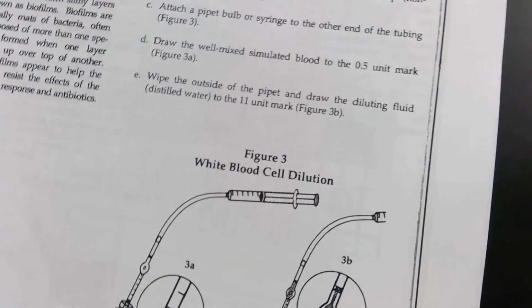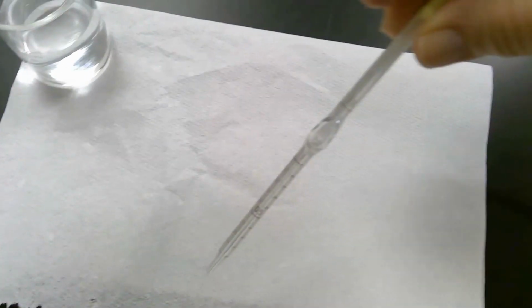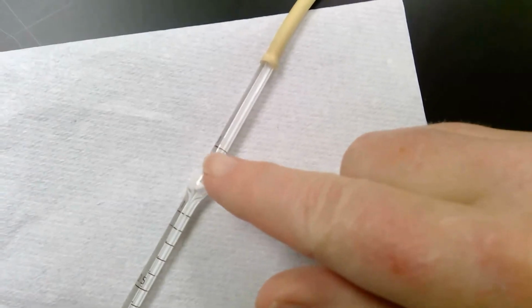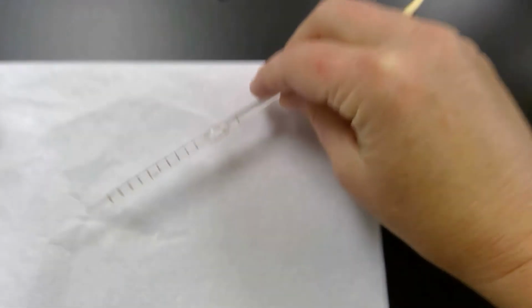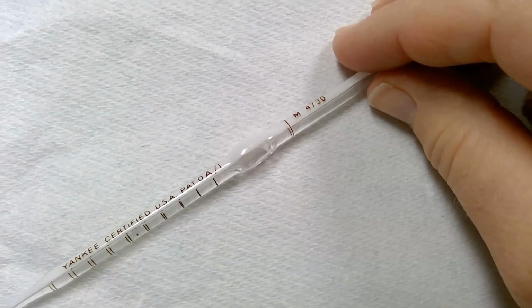So I'm showing you this picture in your instructions. This is the actual device. So what we do is we put some blood in here and we put some water in here. So I have a beaker of water. And you get that blood and water into this little chamber here. You can kind of see this expanded part. Then once you have them in there, you cover the ends of this and you shake it up to mix them, so that then you have a diluted sample of blood in that chamber.